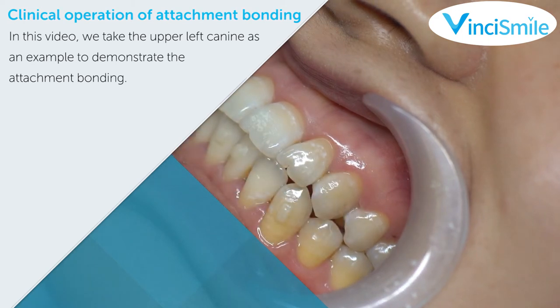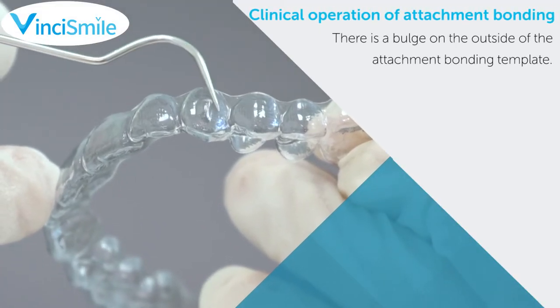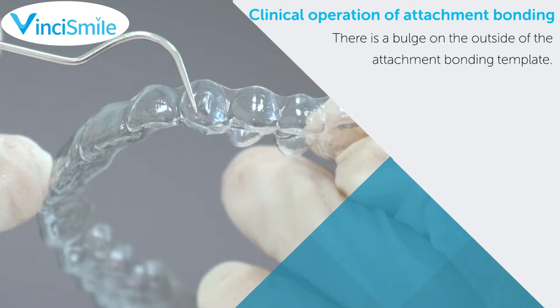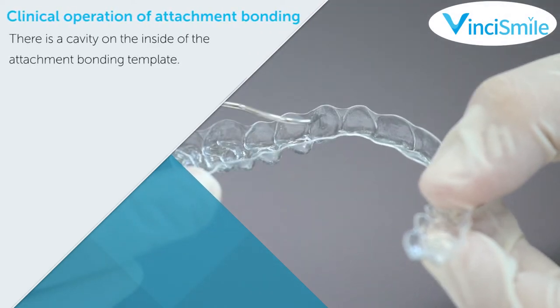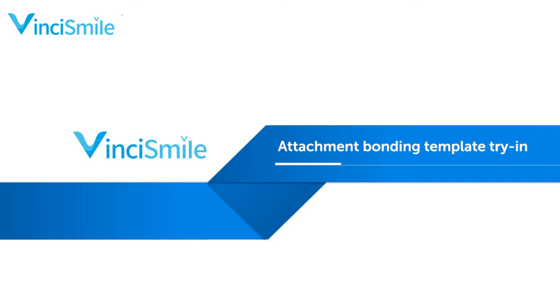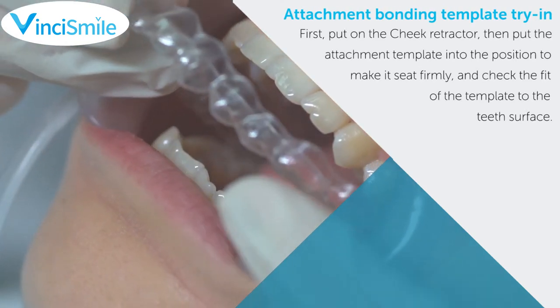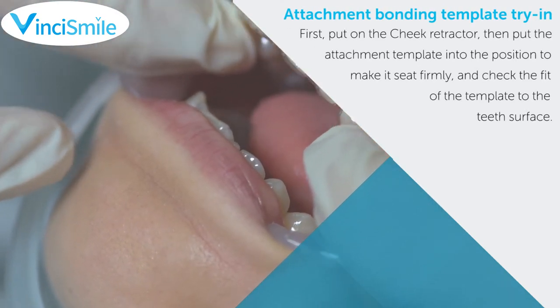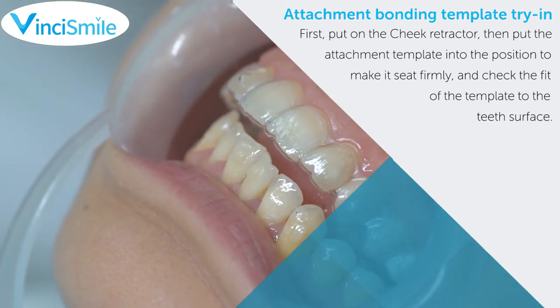In this video, we take the upper left canine as an example to demonstrate the attachment bonding clinical operation. There is a raised surface on the outside of the attachment bonding template, and a cavity on the inside. Attachment bonding template try-in: first put on the attachment bonding template into position to make it sit firmly, and check the fit of the template to the tooth surface.